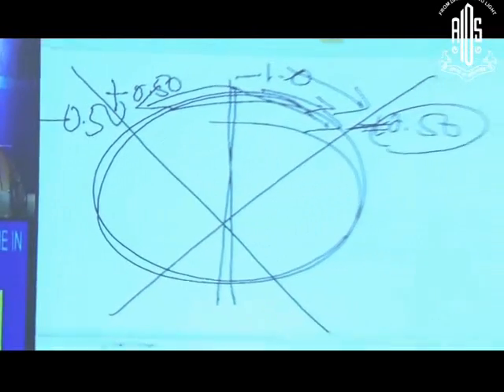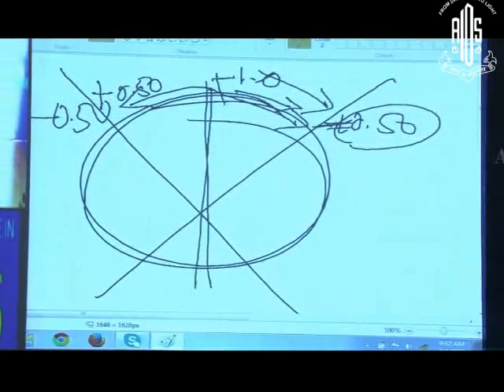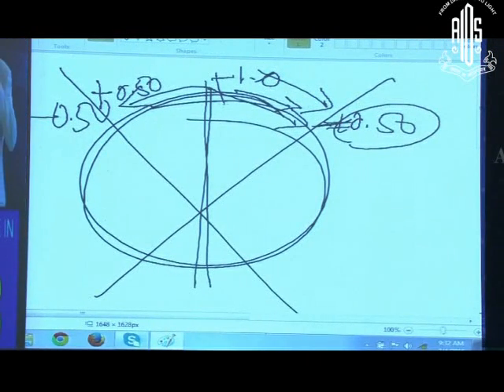So then what you have to do is shift the test cylinder towards the corresponding sign of the cross cylinder. Where was the minus cylinder? It was on this side. So you shift your test cylinder, the main cylinder, towards this side. If he had seen it better the first time, then the minus cylinder was on that side, so you shift the test cylinder towards the minus sign. If this cylinder were plus, then see where the plus is in the cross cylinder, and turn the test cylinder towards the corresponding sign. You can just turn it by 5 to 10 degrees to see whether the vision improves.